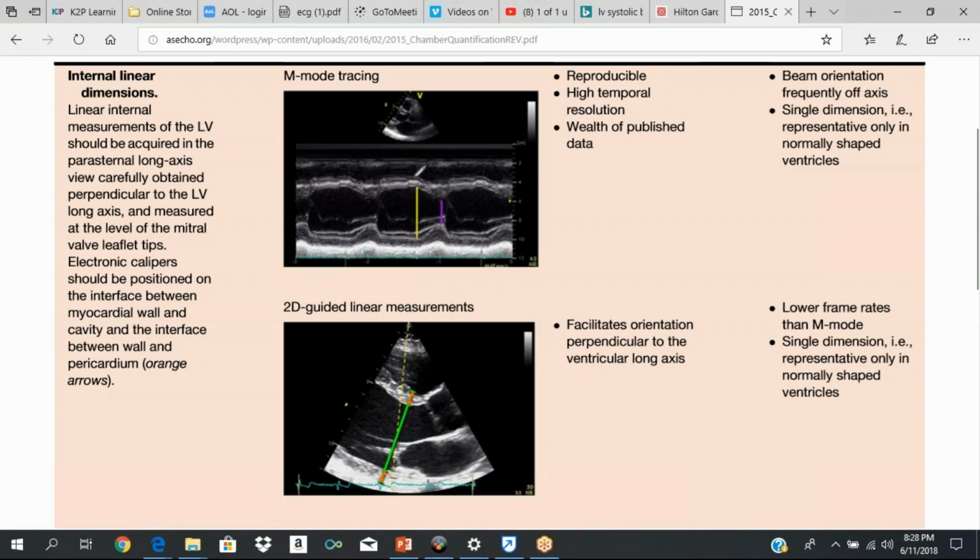To measure the septum, you move from the top of the septum to the bottom, okay? And it's a diastolic measurement, okay? From the top to the bottom, okay? Septal thickness. Posterior wall, again, from your blood tissue plane to the pericardium, and you just measure that. These are all diastolic measurements. This is using M mode.